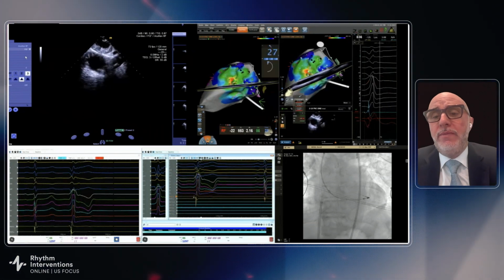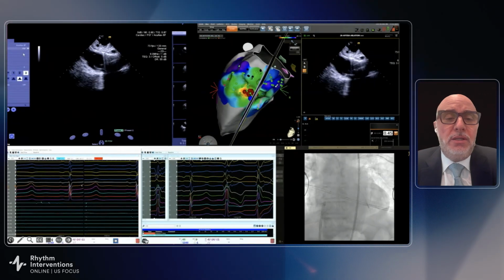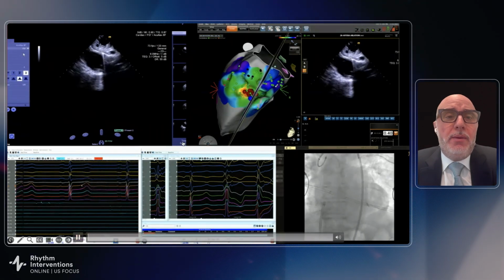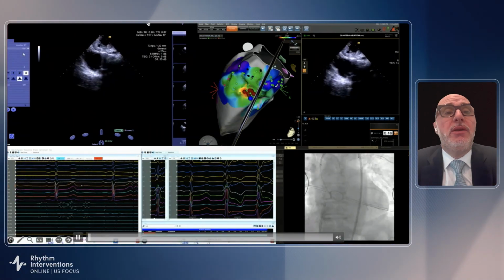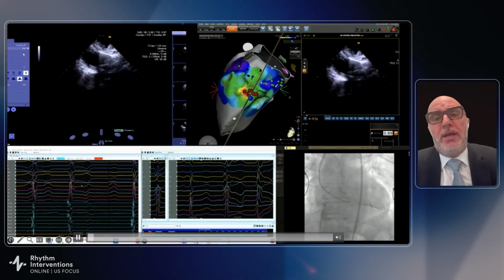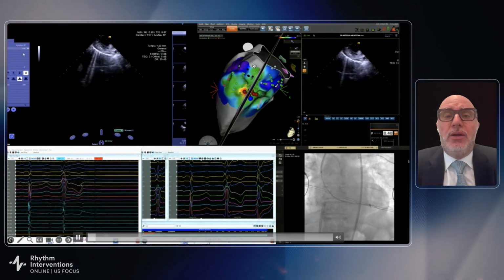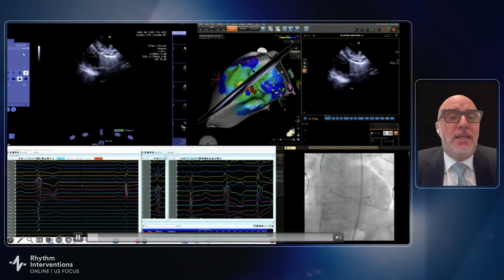So we prepared to consider alternative technologies, and we used Afera, but not with a ventricular setting, with atrial settings. You can see here again the intracardiac echo. The beauty of using sound is that if you have your imaging plane in the area that you want to focus on, you can see perfectly the image that corresponds to that area. So I can tell you exactly where my lesions were, and you can see in ICE that region.